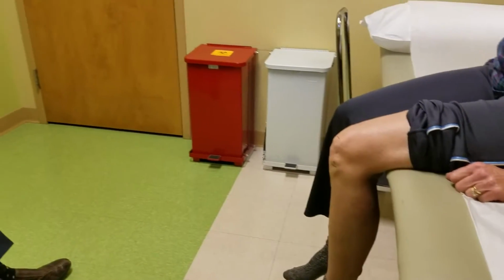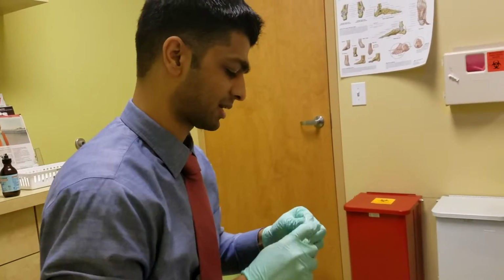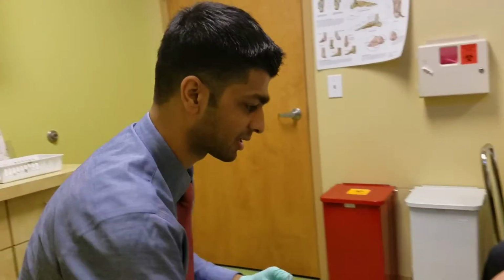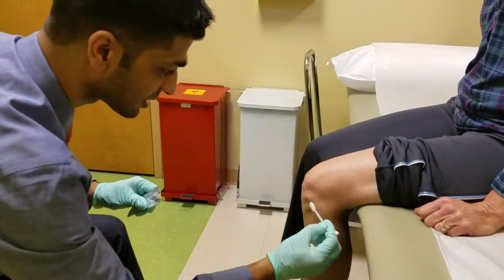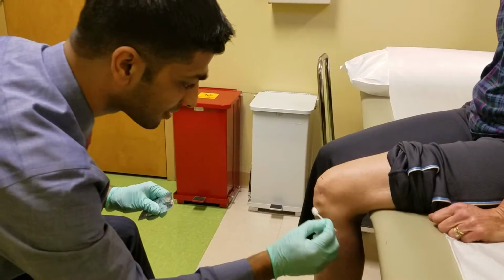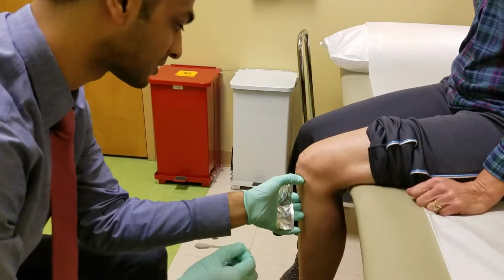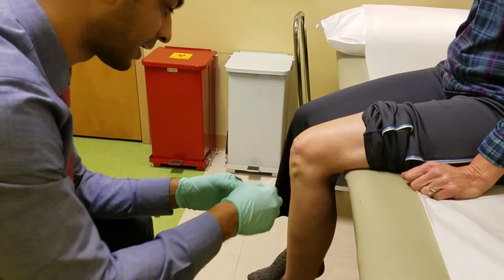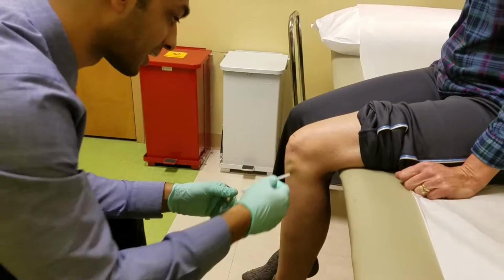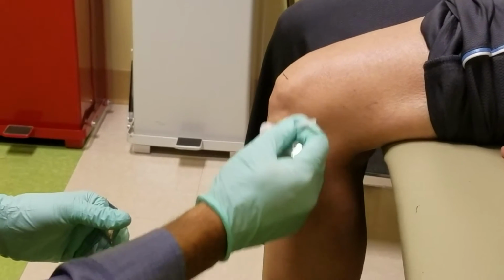And then when injecting, step one is marking your landmarks. Next, you sterilize the skin with whatever sterilization technique you want, and of course that rubs off all of my anatomical landmarks. And you can confirm one more time exactly where we're going. I actually use the back of my chlorhexidine prep to mark it in the skin, so it just indents the skin a little bit there. And we let that set up.